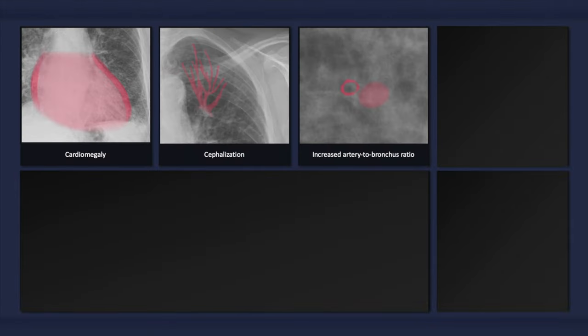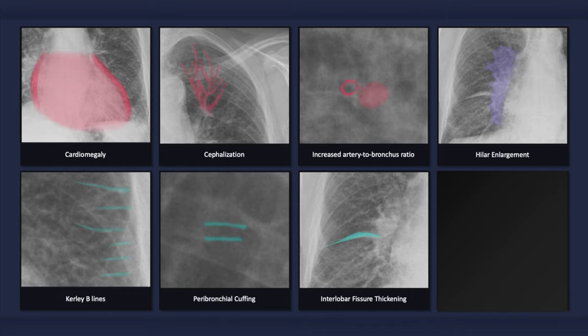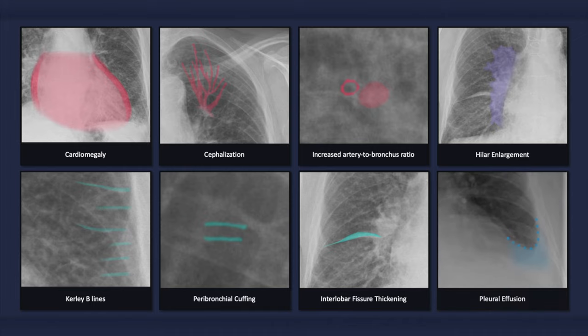The plain radiographic findings that can occur with congestive heart failure include cardiomegaly; signs of vascular redistribution, such as cephalization and increased artery-to-bronchus ratio in superior segments; signs of pulmonary vascular congestion, such as hilar enlargement and a widened vascular pedicle; signs of pulmonary interstitial edema, such as Kerley B-lines, peribronchial cuffing, and interlobar fissure thickening; pleural effusions; and in more severe cases, alveolar edema.